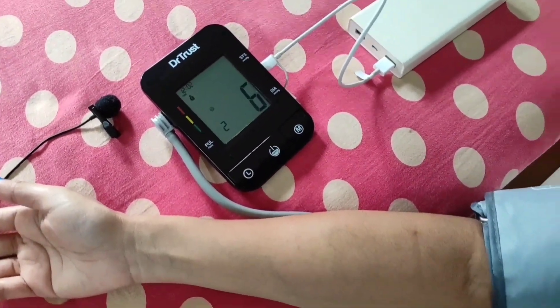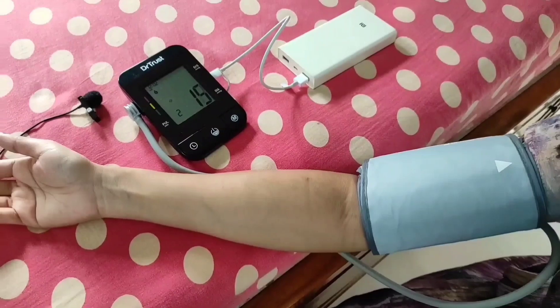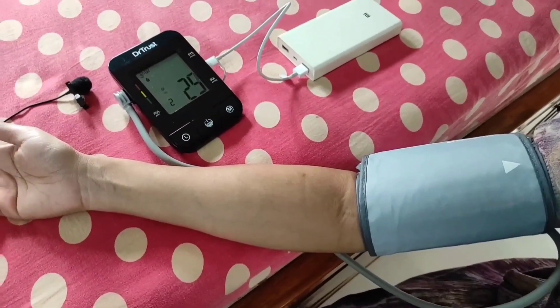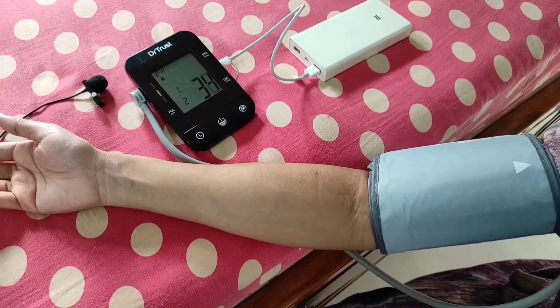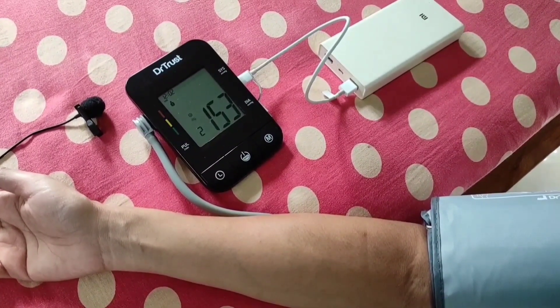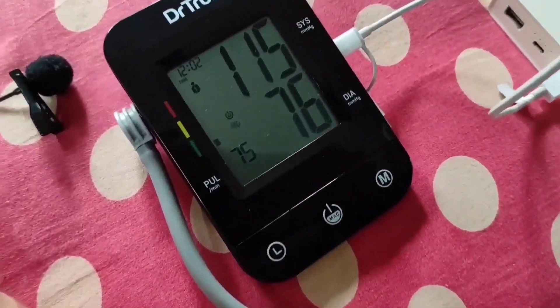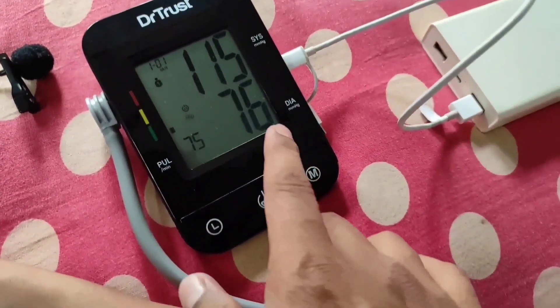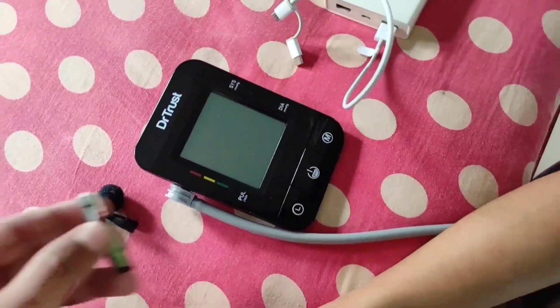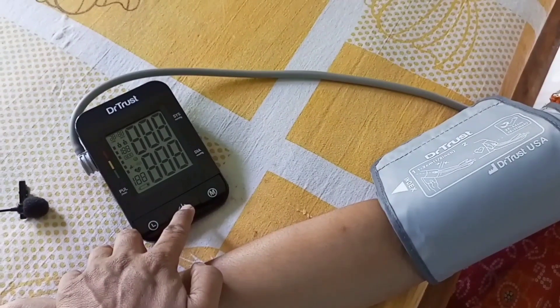Notice that the lower left corner now shows 2, meaning it is the second reading, and the cuff pressure increases again for the second measurement. After both readings are taken, you can see the average result of the two readings: 115 systolic and 76 diastolic pressure. Now I am disconnecting the power bank and operating the BP monitor through batteries.